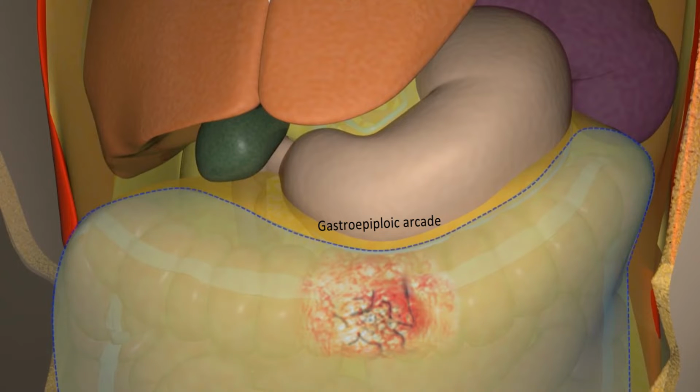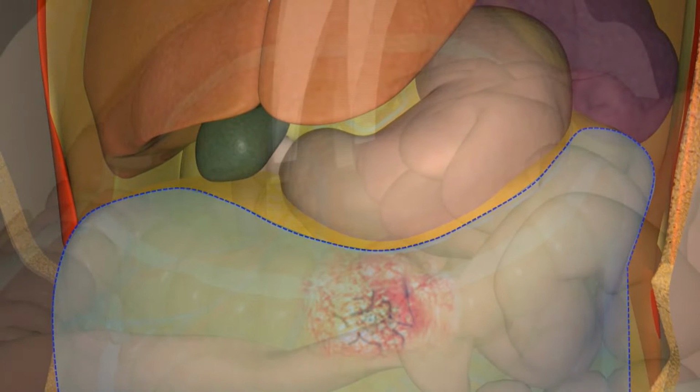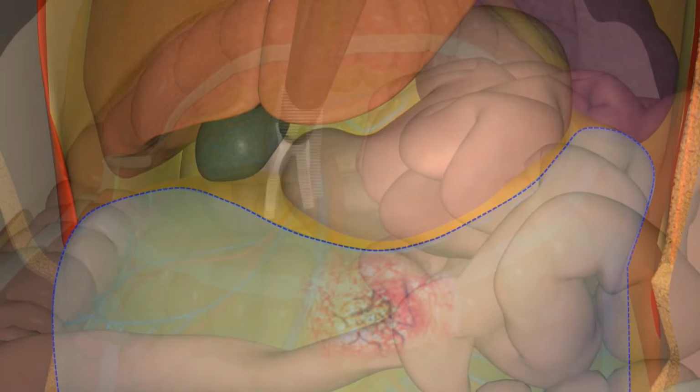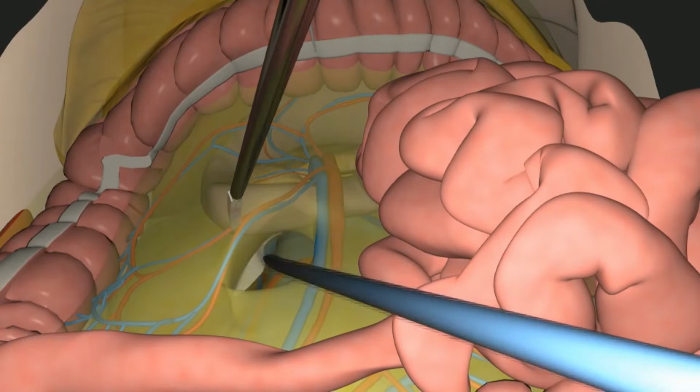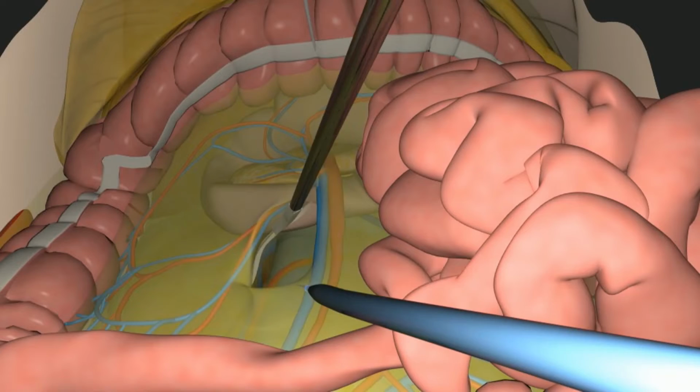Moreover, metastatic lymph nodes can be detected along the gastroepiploic arcade at the greater curvature of the stomach. Transverse colon tumor may reach the gastroepiploic arcade even by continuous growth as well. This animation shows the surgical resection margins for the transverse colon carcinoma.